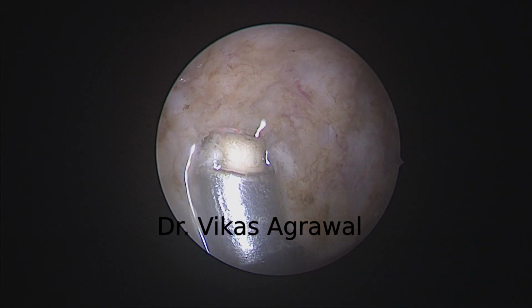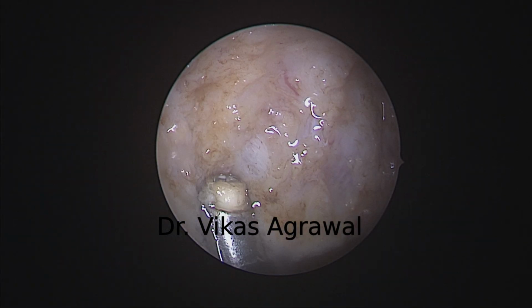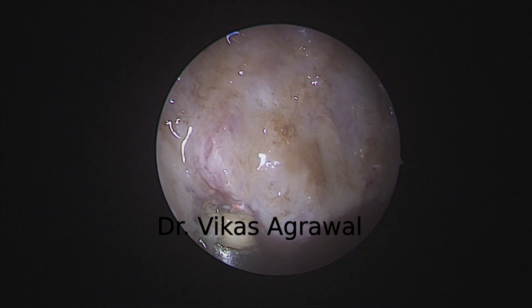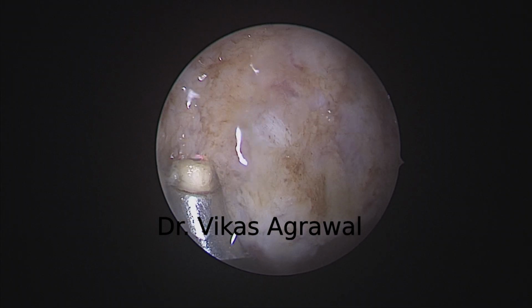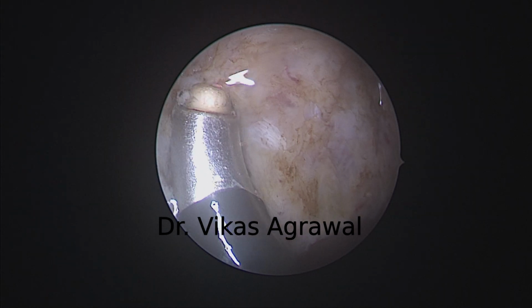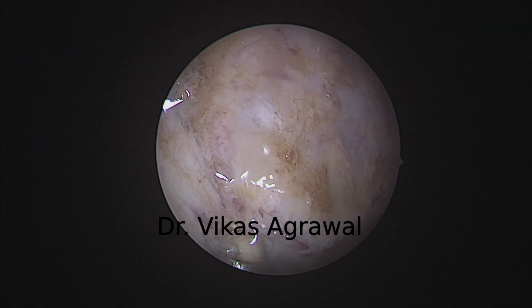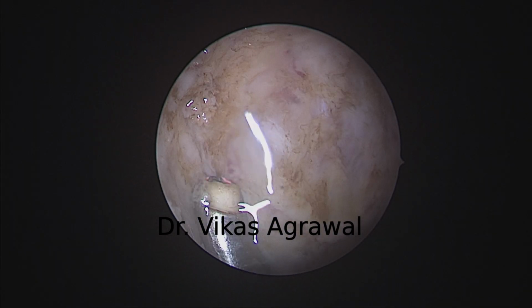If I need another wand, I'll open it up. I have kept it ready. Let me see. And that's the lateral extension. That's the fossa of Rosenmuller. Very carefully, this wand is almost exhausted now, but my work is also almost complete.